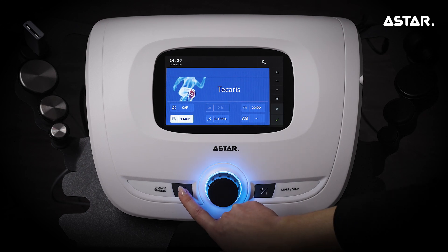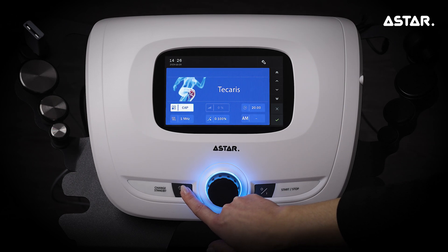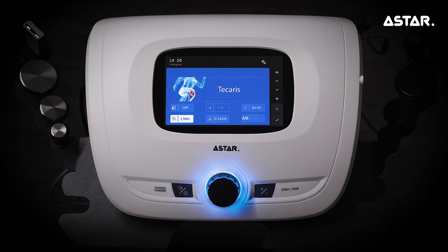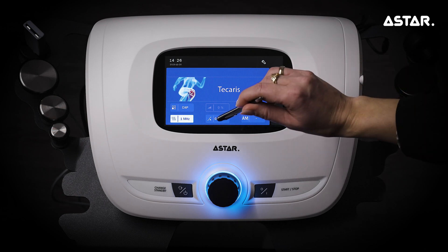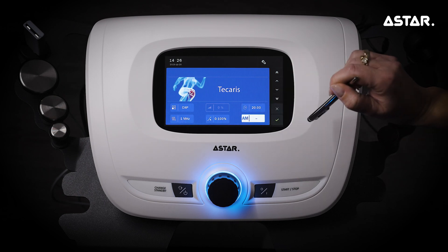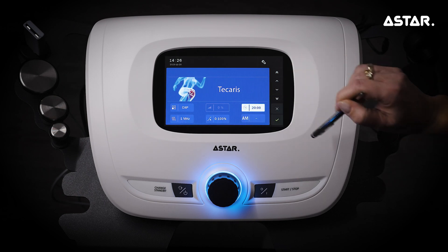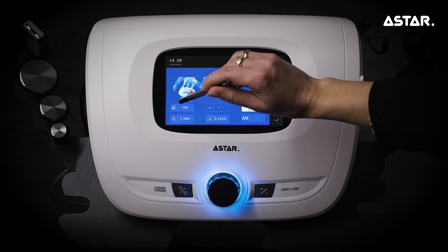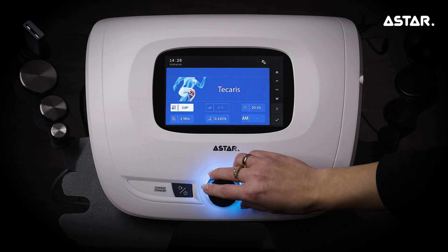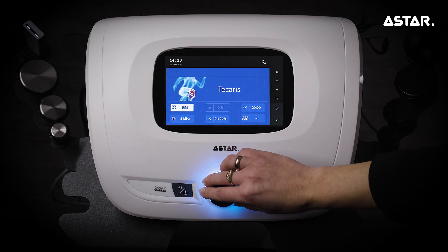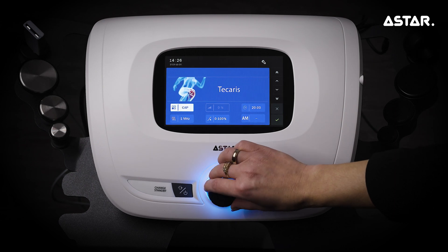Press the change standby key to change the parameter that is being edited. You can also change the parameter to be edited using the buttons on the touch screen. Set the parameter value with the knob or use the navigation bar on the right side of the display.